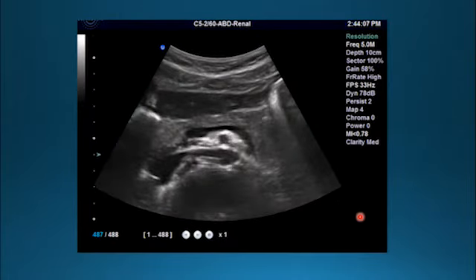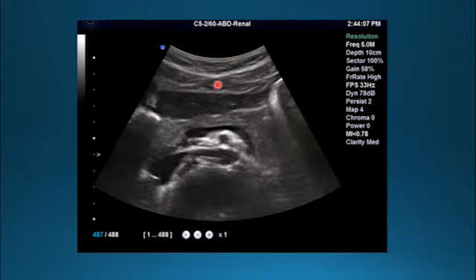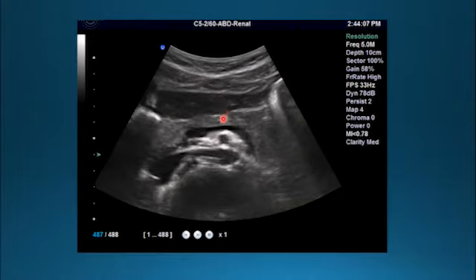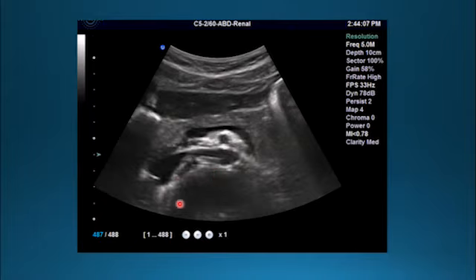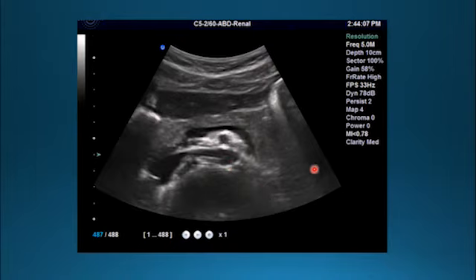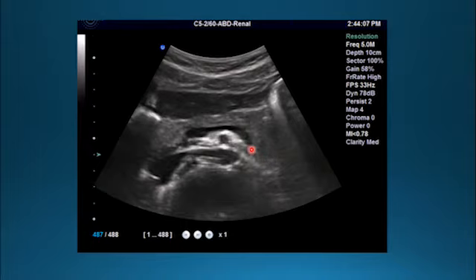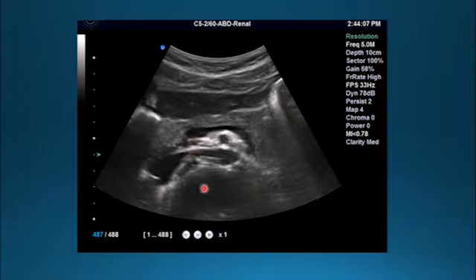Here's a transverse image of the pancreas in the middle of the screen. You have subcutaneous tissue, some muscle, the left lobe of the liver, and as you go more posterior, the body of the pancreas, the splenic vein, the SMA, and the aorta, with the vertebral body behind. You also have the IVC and the left renal vein coursing between the aorta and the SMA. The spleen is to the patient's left; the splenic vein courses medial, posterior to the pancreatic tail and body, then forms the confluence with the superior mesenteric vein, which heads off into the liver as part of the hepatic portal system.